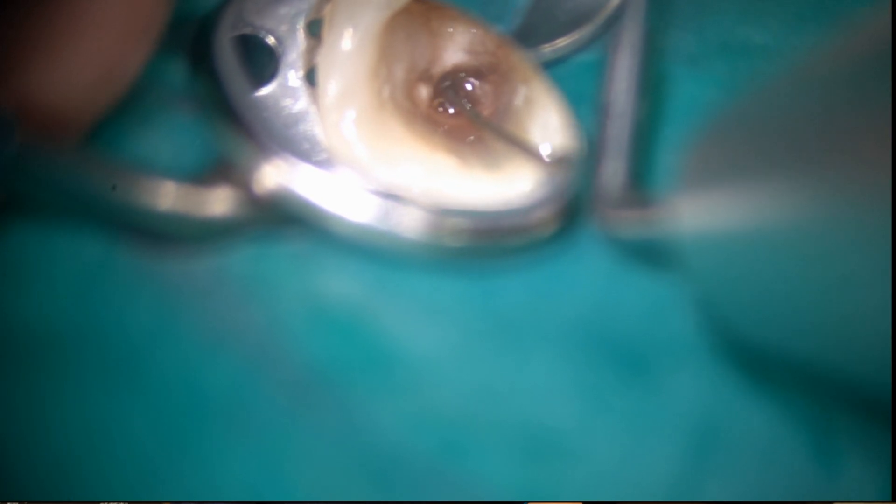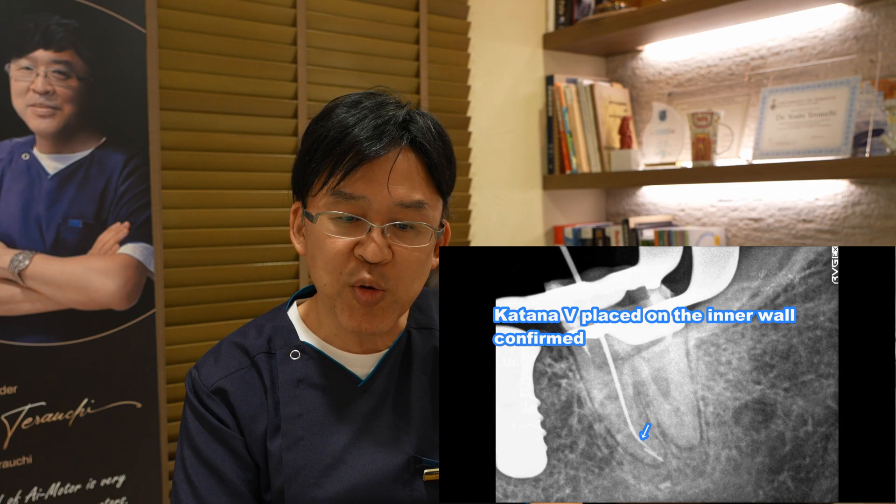When I use the key, I take a radiograph to make sure I'm positioned in the space on the inner wall.